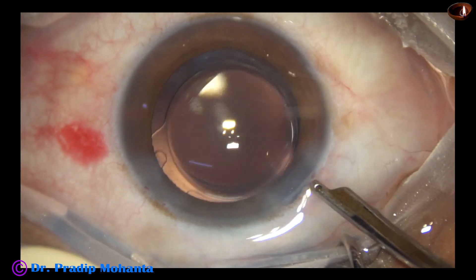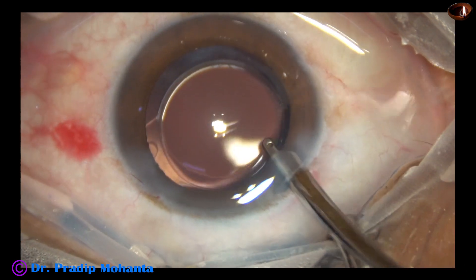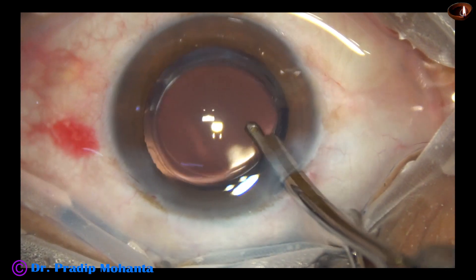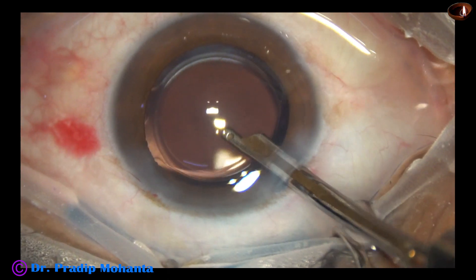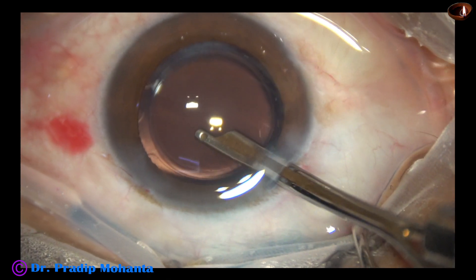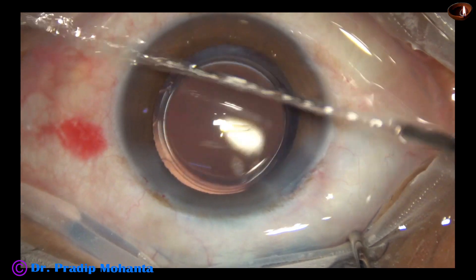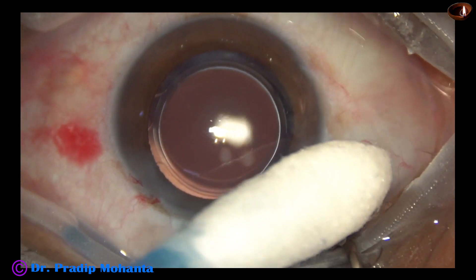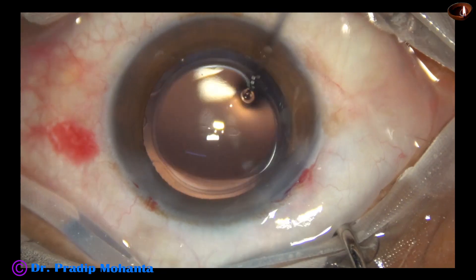I always do a final lavage of the anterior chamber, and this reduces TAS — Toxic Anterior Segment Syndrome. The anterior chamber is nicely formed. Integrity of all the wounds is checked with a cotton tip in a Johnson & Johnson fashion, and the case is concluded.